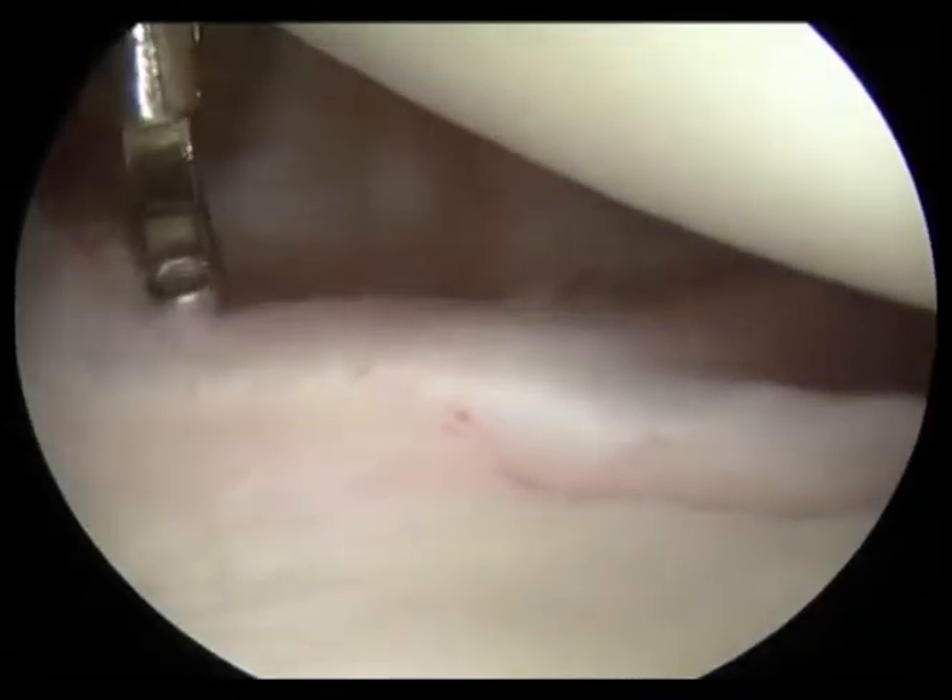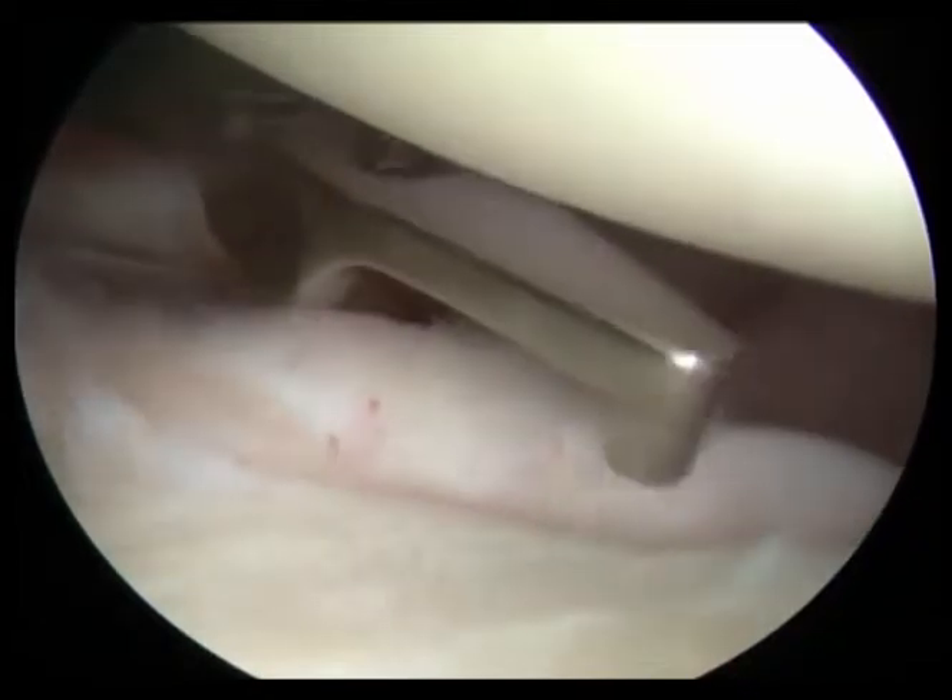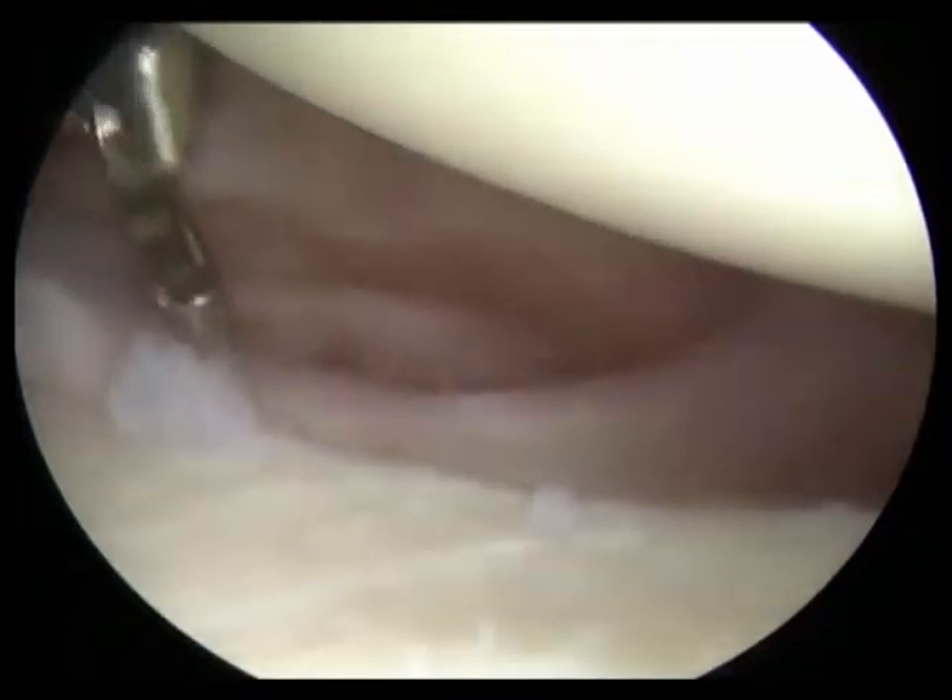Here we are fixing a shoulder labral tear that occurred because of a dislocation. You can see this probe is demonstrating how the labrum was torn loose.